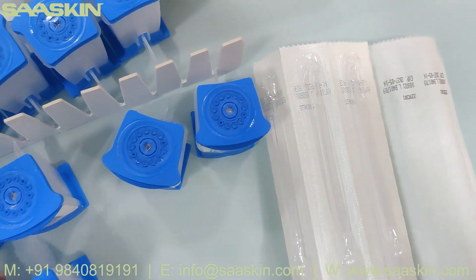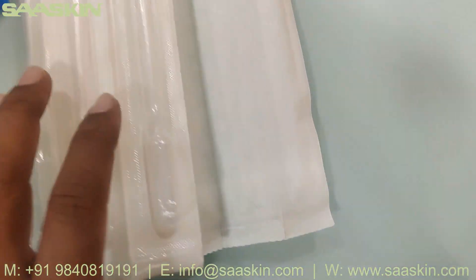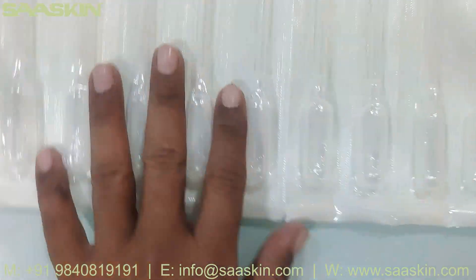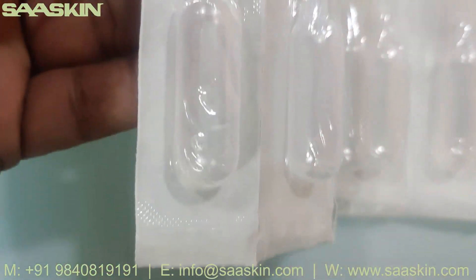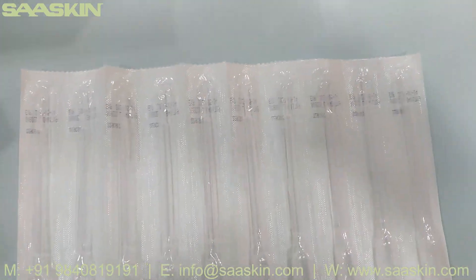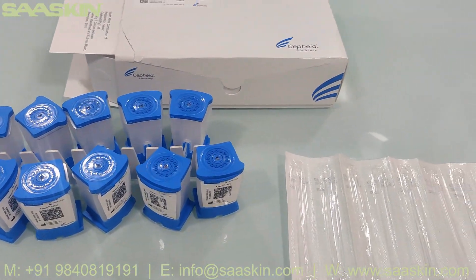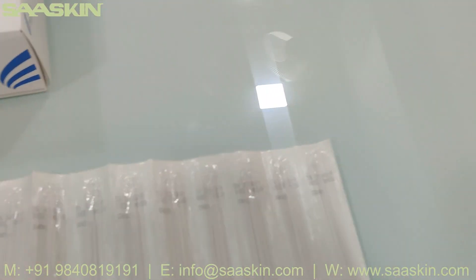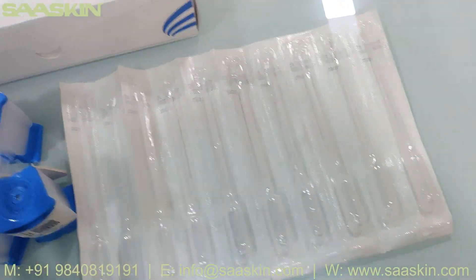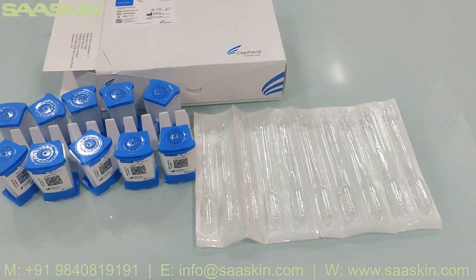So you have 10 cartridges here, and you can see there is a capillary filler tube — you can see the capillary filler tube here. All these are used in the GeneXpert machine. This is basically for a particular closed system GeneXpert machine.